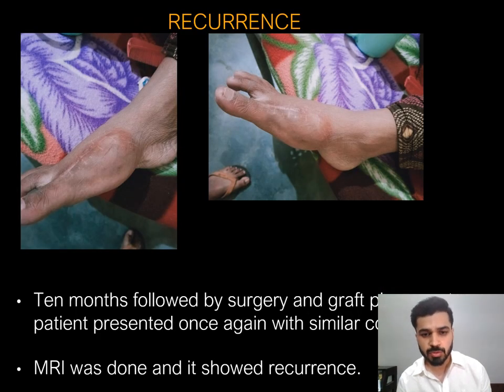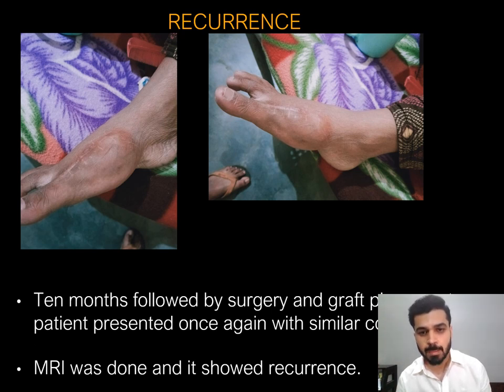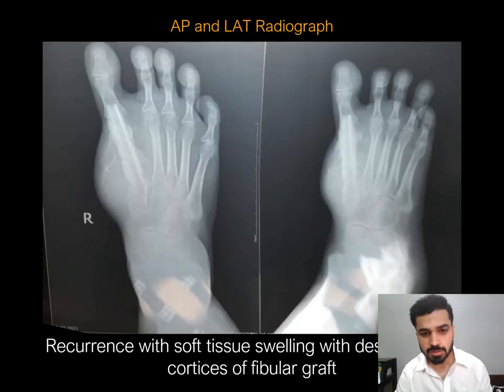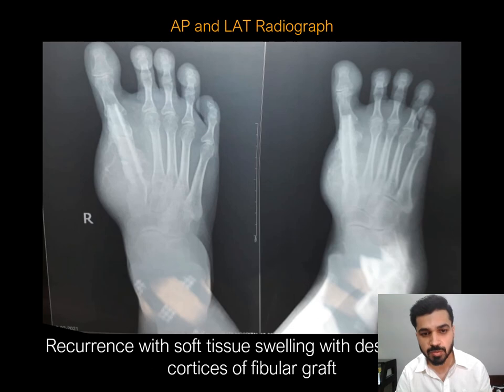Ten months following surgery and graft placement, the patient once again presented with similar complaints of swelling and pain in the right metatarsal region. MRI was performed. On the AP and lateral radiographs of the foot, there is marked soft tissue swelling along the first metatarsal, also showing destruction of the cortices of the fibular graft.